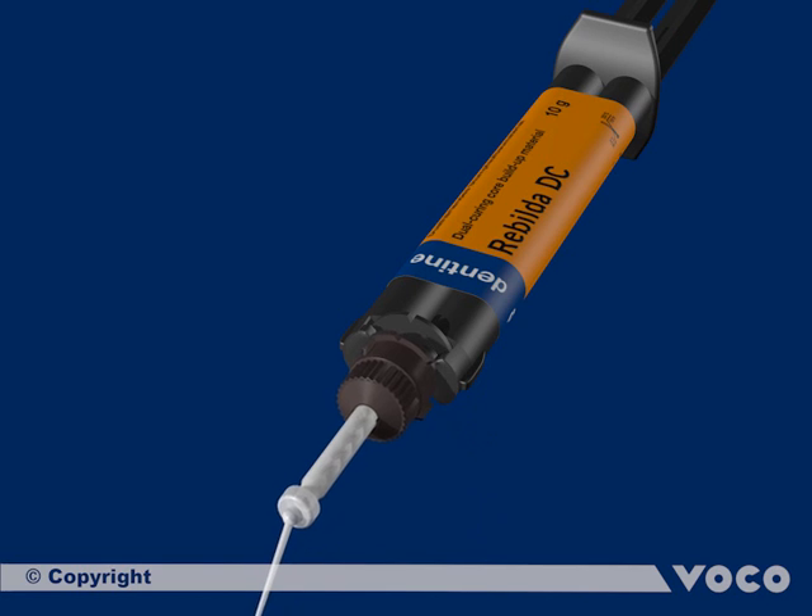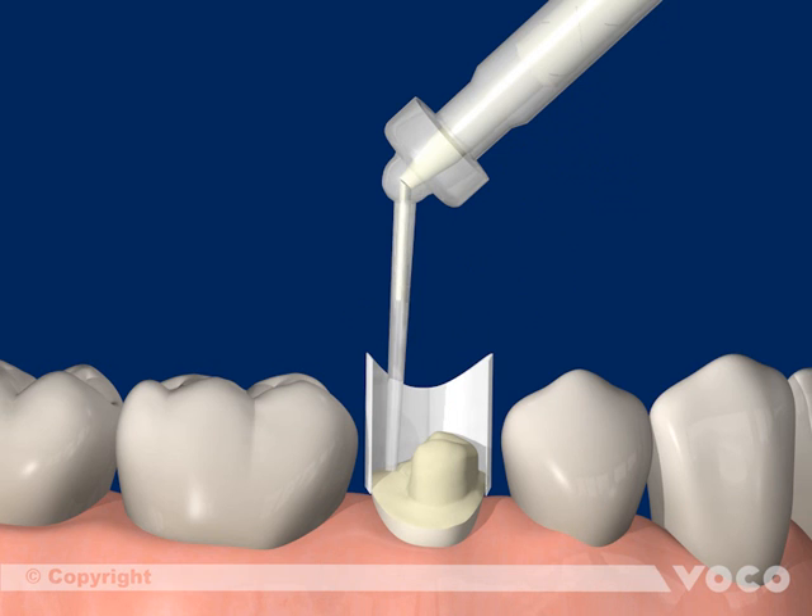After attaching the mixing cannula, the dual curing material is filled into the matrix. The filling should start at the deepest point to prevent air bubbles.